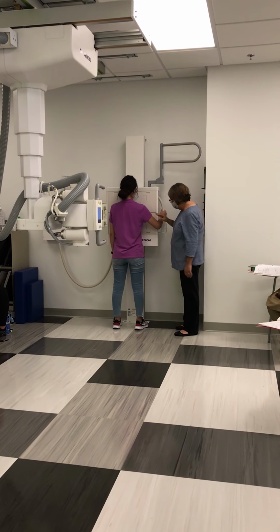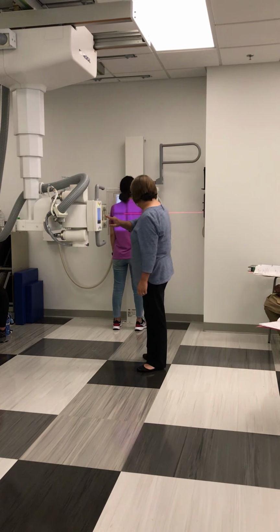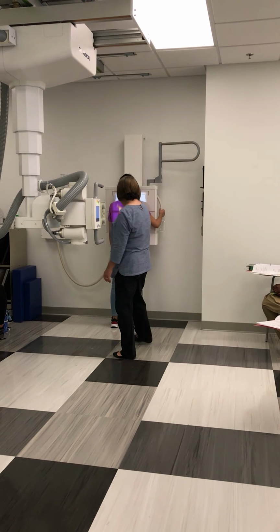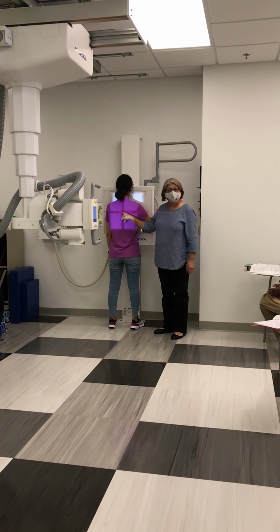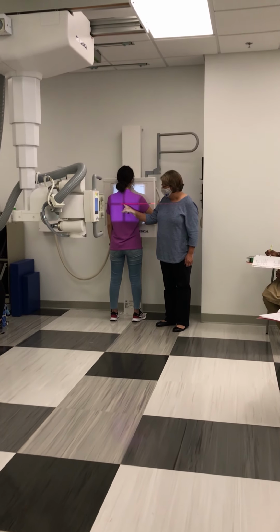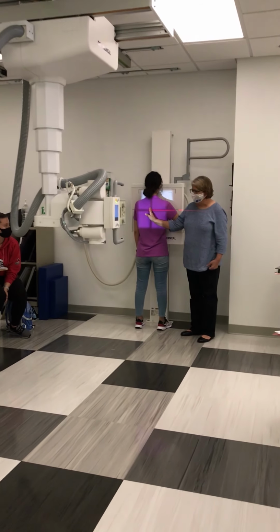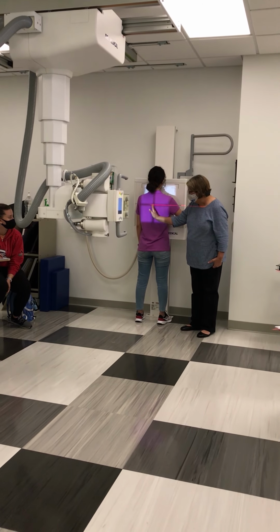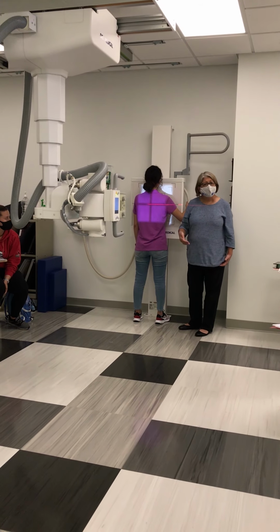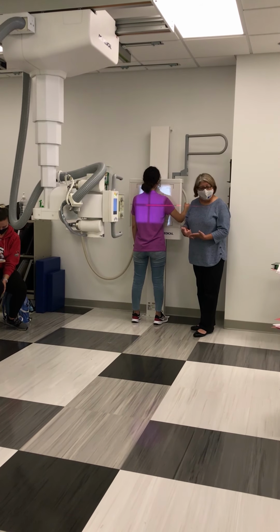Now then, I'll have you stand with your chest against the board, forward, stand with your feet shoulder width apart. Grab a hold of that bar, that's good. Now I'm going to center. I know this is your central ray, right in the middle of those crosshairs. So I know that I need to center at the mid-sagittal plane, and I'm also centering at the level of T7.